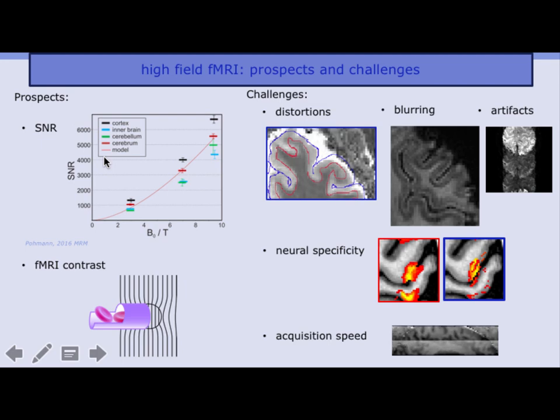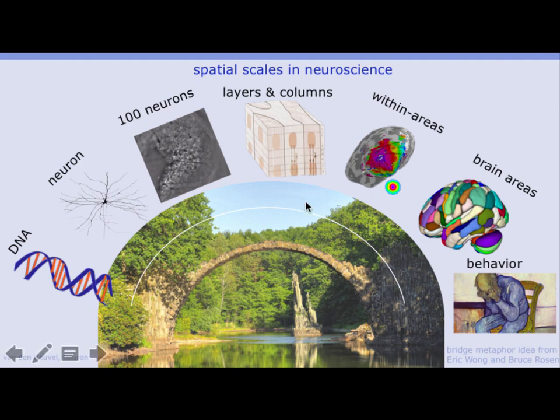For my focus of very high spatial resolution imaging, to get to these layers, I think we shouldn't worry too much about the temporal resolution. I'm super happy to make compromises in coverage or temporal resolution, because I believe we really need to close the bridge over here. And as soon as everything's stable, we can build on top of that and push it further. But we first need to get something at all, no matter how the temporal resolution is. Does that answer your question?